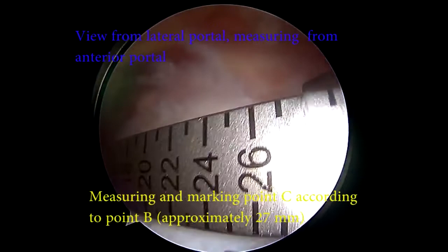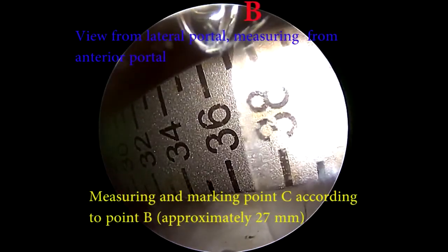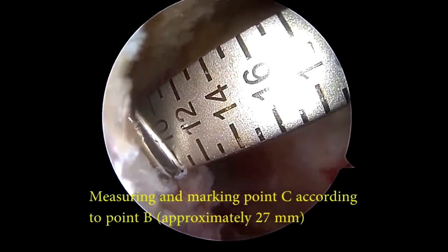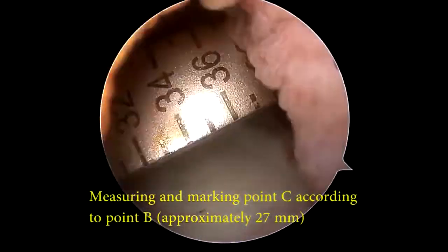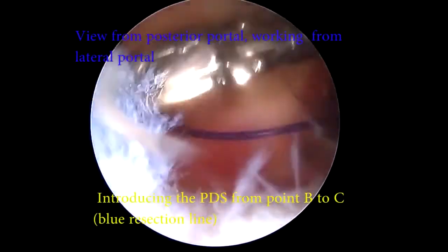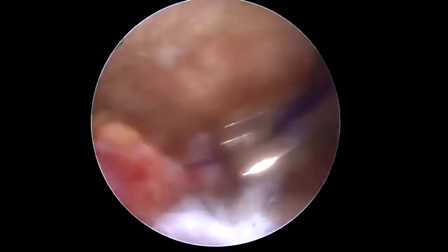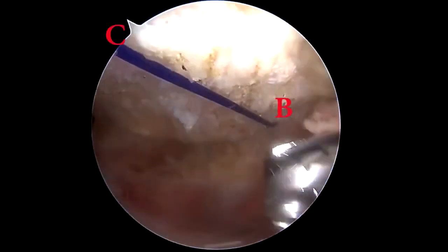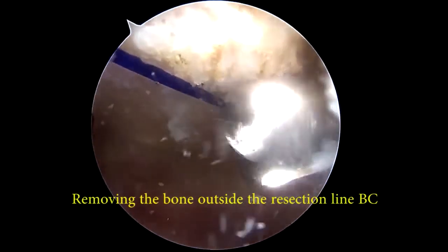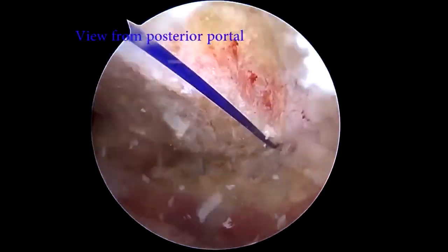Then the lateral portal is used as the viewing portal and the anterior portal is used as the working portal for measurement. The point C is identified by measuring the distance of BC and also marked with a spinal needle. A 0# PDS suture is introduced under arthroscopy from point B to C through the inner core of the straight needles, and the blue resection line BC is made. Next, the region of the acromion outside the blue resection line is gradually resected via the lateral portal.